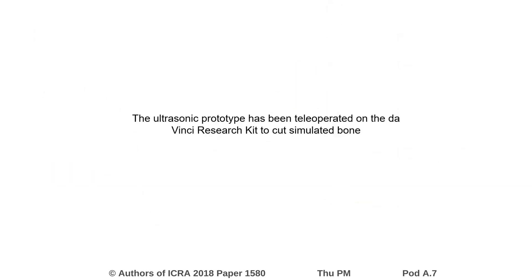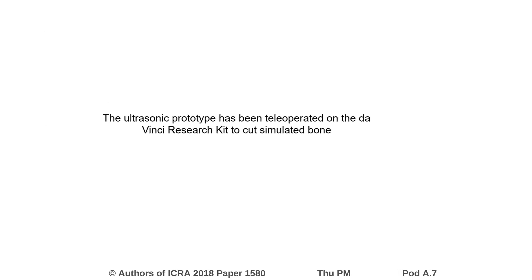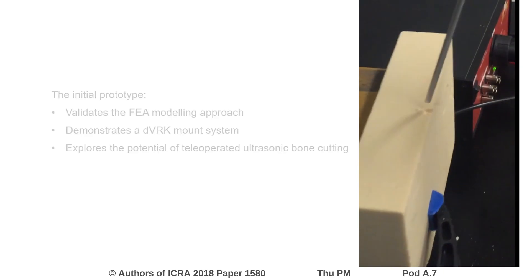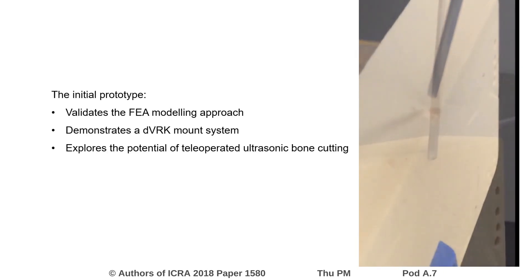The prototype has been successfully tele-operated and used to cut simulated bone. A video of one of the first cutting tests is shown on the right. The initial prototype serves to validate the FEA approach and is the first test of a tele-operated ultrasonic system.